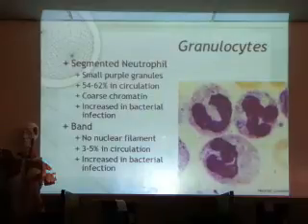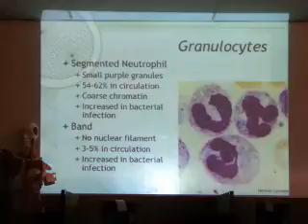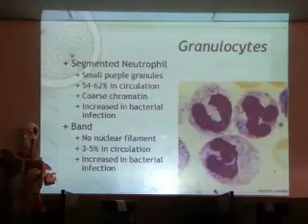They're about 14, 15, 16 microns in diameter, just like any other granulocytes. The granules are not as large, they're pretty small, and they don't stain as well as basophils or eosinophils. That's why we call them neutrophils. But they do stain a light purplish color. You can see the small granules in the cytoplasm. The chromatin pattern is very obvious, a very dark, thick chromatin pattern. We call that a coarse pattern. So you have a thick, dark area, and then you also have a very obvious light area. So the parachromatin, euchromatin differentiation is very obvious.